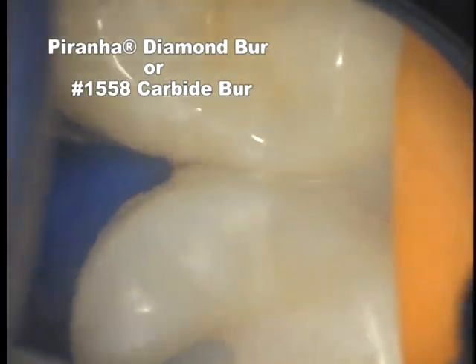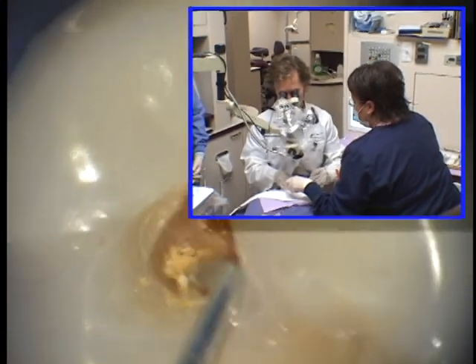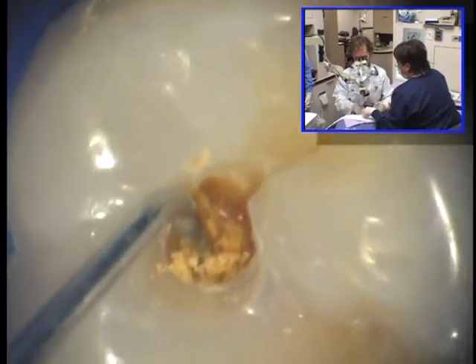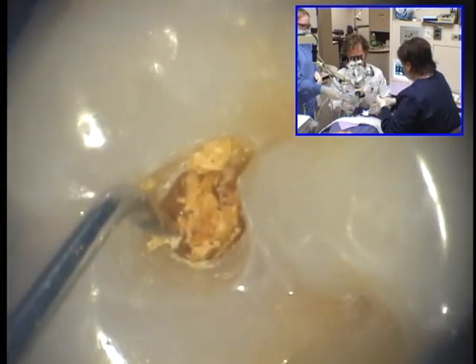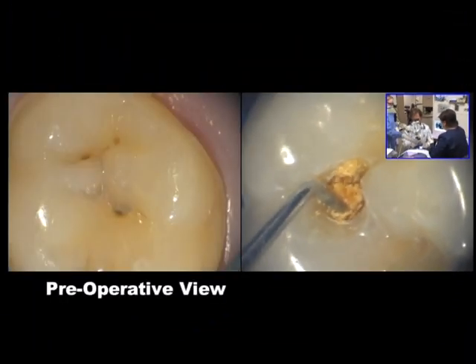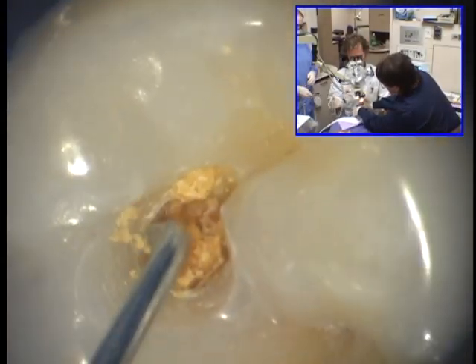Once we discover significant dentinal caries, that area of the tooth changes from micro-dentistry to macro-dentistry, and so we change to a round-ended large diamond or carbide burr. Let's compare the preoperative view with the mid-treatment view — note the subtle discoloration suggesting decay. Contrast that to the gross decay that we actually uncover. This level of precision and permanence is difficult to achieve without magnification and the use of instruments such as the fissurotomy burrs.